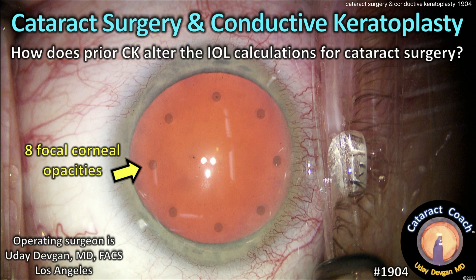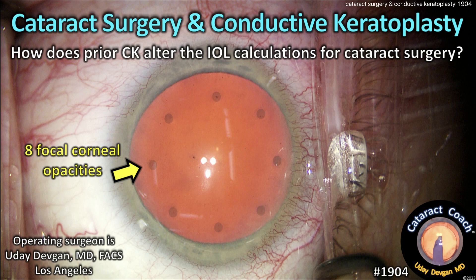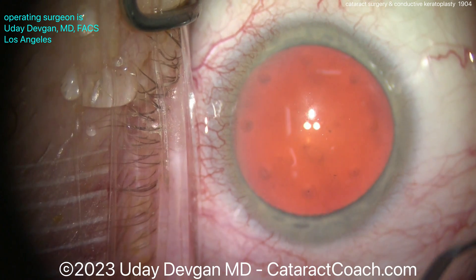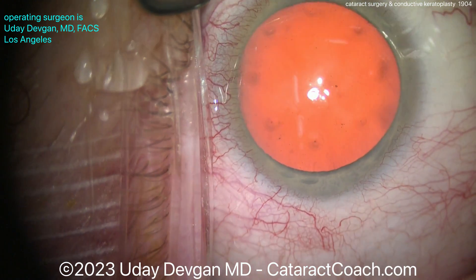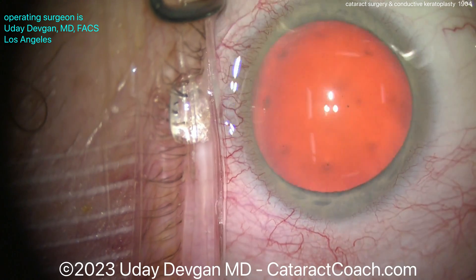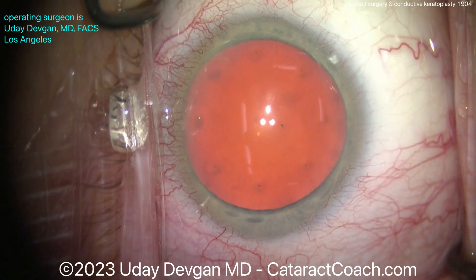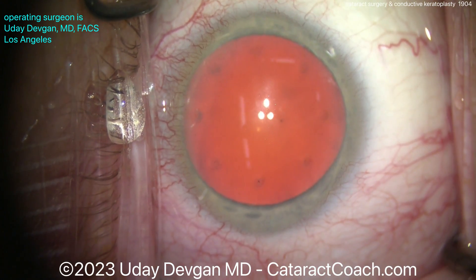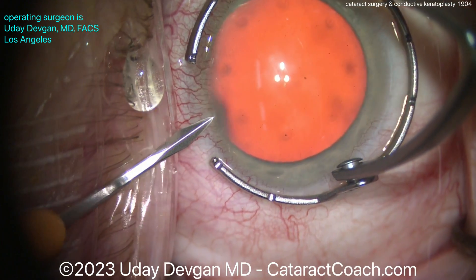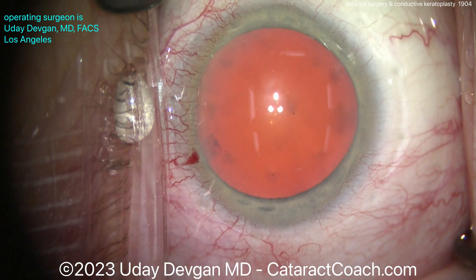CataractCoach.com: Cataract Surgery and Conductive Keratoplasty. How does prior CK alter the IOL calculations for cataract surgery? Take a look carefully at this cornea — you can see there are 8 spots. Those are the spots from the conductive keratoplasty, a refractive procedure from about 20 years ago, around the year 2000, where a little electrode was used to cause focal burns in the cornea. Those peripheral 8 burns serve to steepen the central cornea and therefore add corneal power.